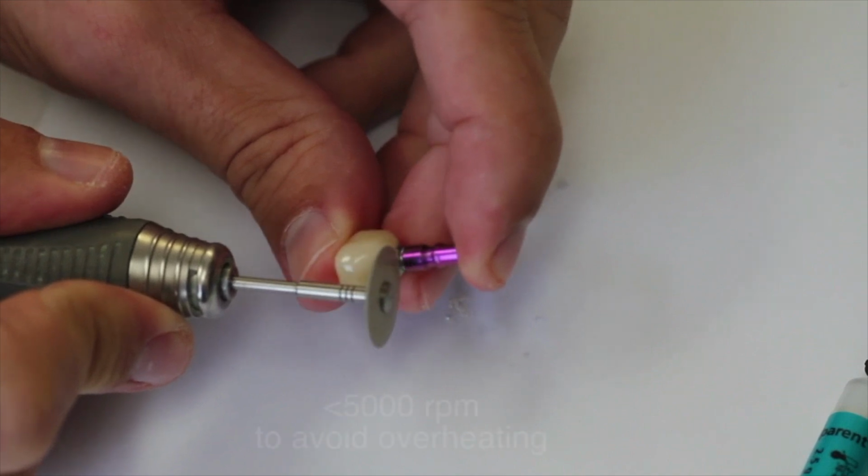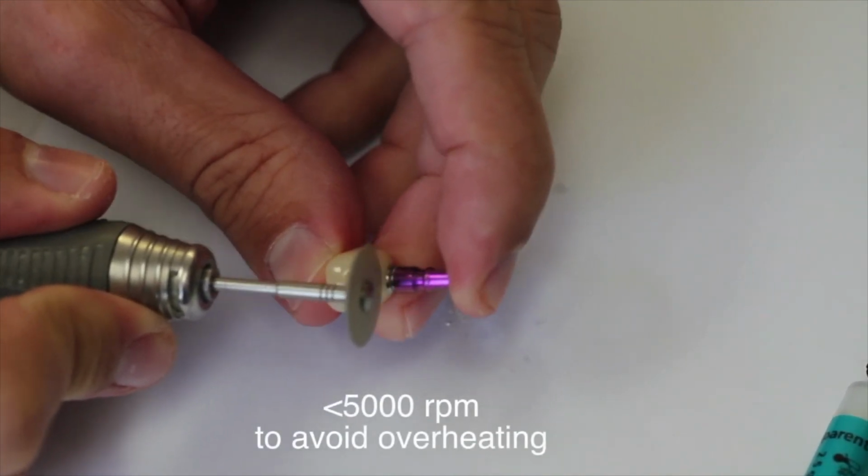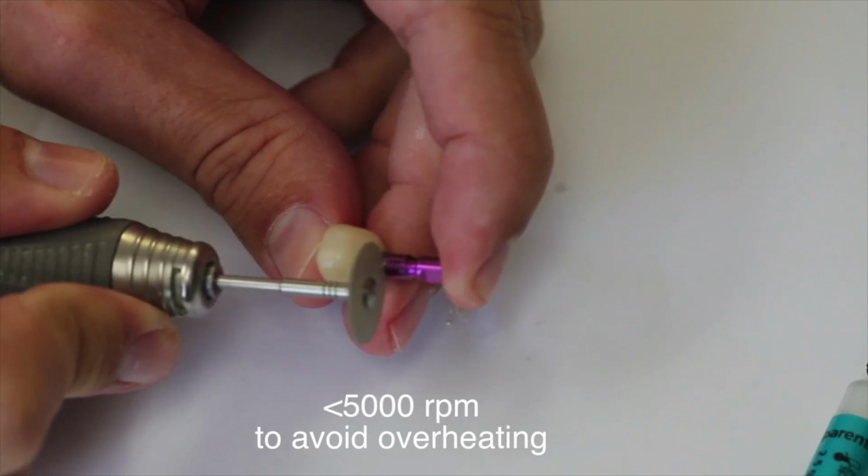The final step in the process is to use rubber wheels to polish the cementation joint. It's very important to use low RPMs to avoid overheating the porcelain.